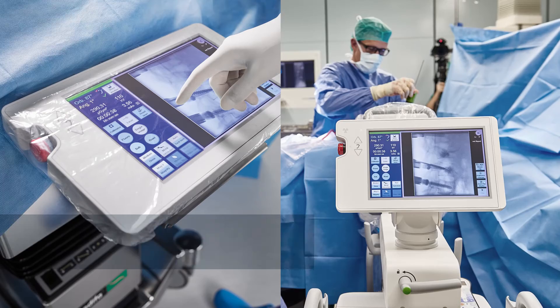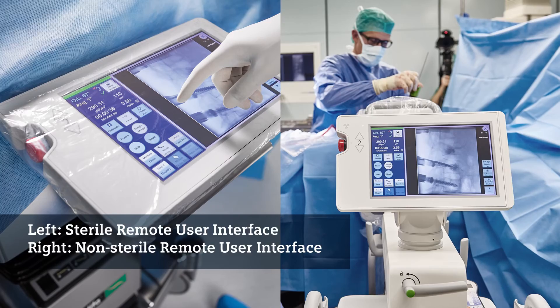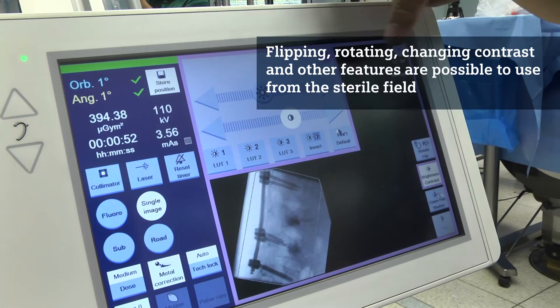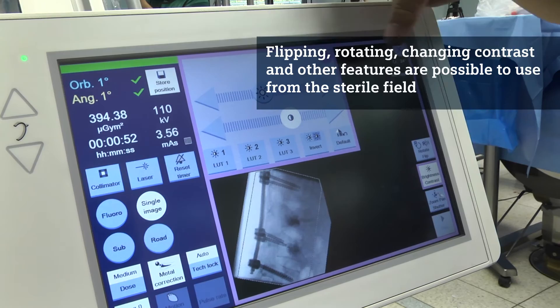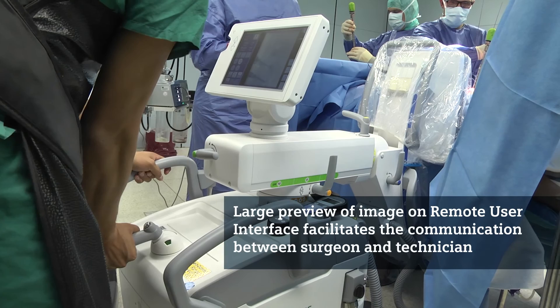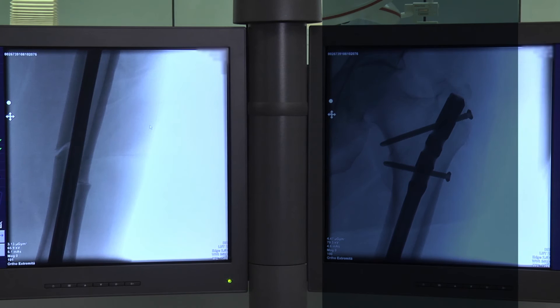For me a new, interesting, and very valuable feature is the touch screen remote control that the surgeon can use right at the intervention site. You can drape it sterile and post-process images as you like — flip, rotate, enhance contrast — which gives you more detailed information. You also have a preview image of the last acquired image, giving you the opportunity to position the C-Arm more precisely without moving to the trolley. Communication between the OR technician and the surgeon is therefore much more facilitated.